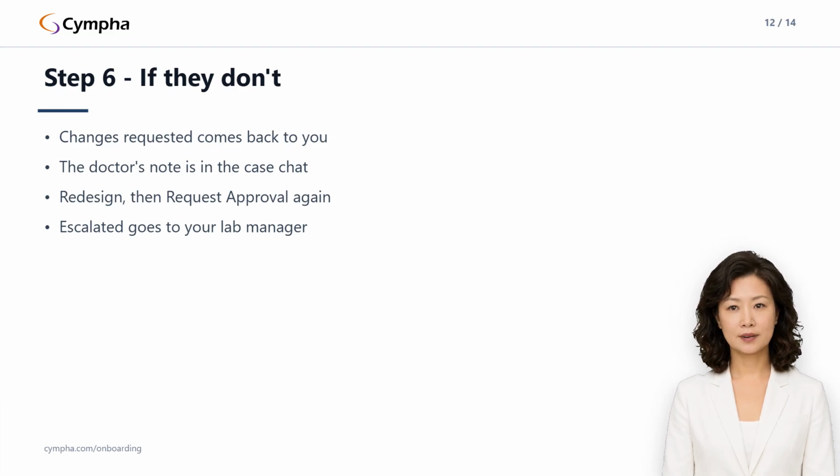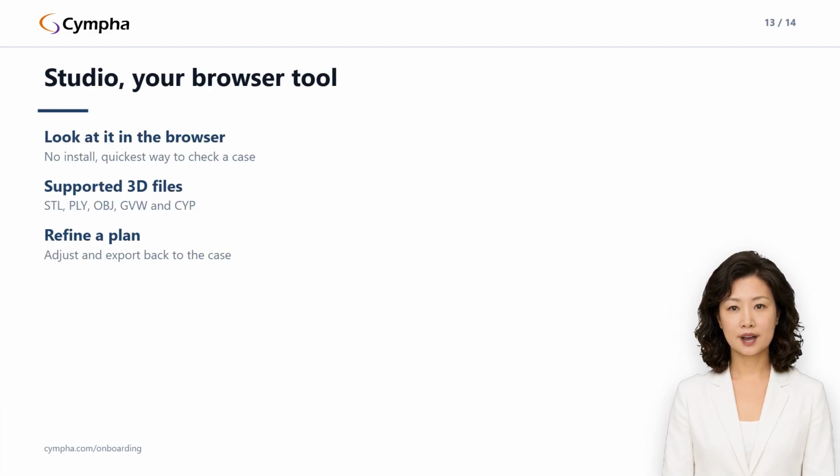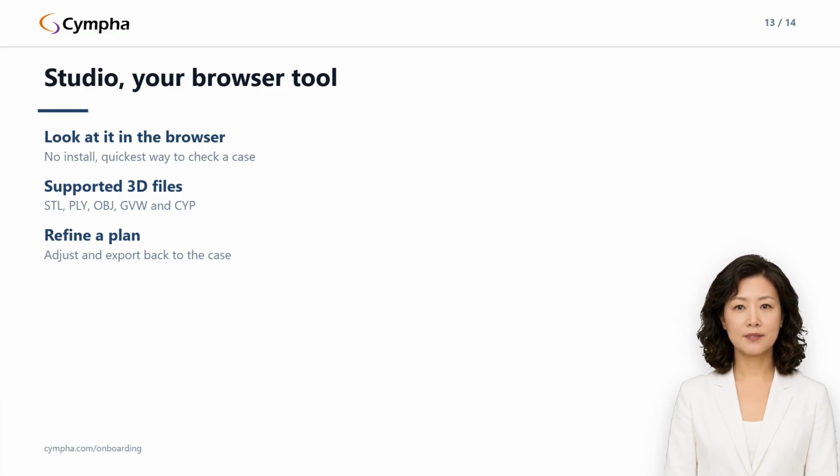A closing word on Studio, because designers tend to file it as the tool for people without real software, and that undersells it. As a viewer, it is the quickest way to look at a case in 3 dimensions when you are away from your workstation, or to decide whether a case is even worth opening the heavy tool for.